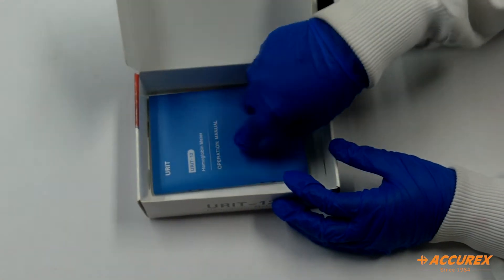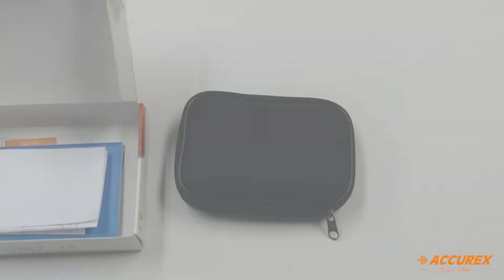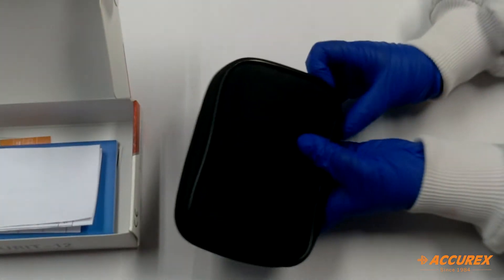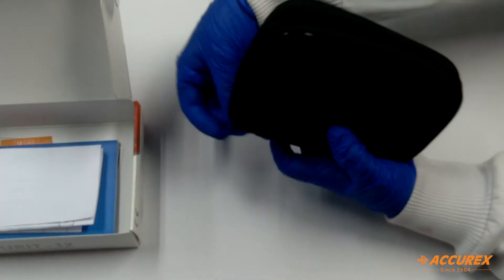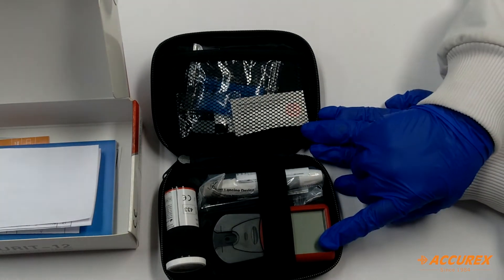This is the operational manual and the warranty card. Now we will see what is inside this black pouch. As you can see here, this is the haemoglobin meter.